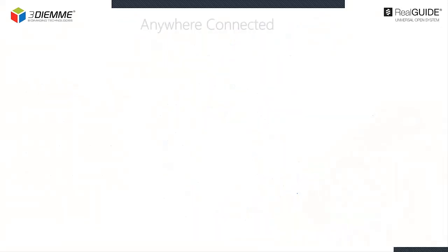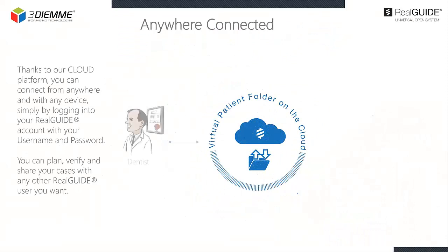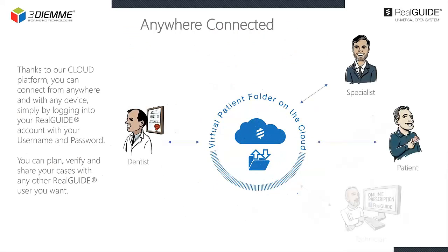In addition to being installed on your device, the software is also available on the cloud platform. This is a great advantage because the user can access his account anywhere and from any device, simply through his own username and password.